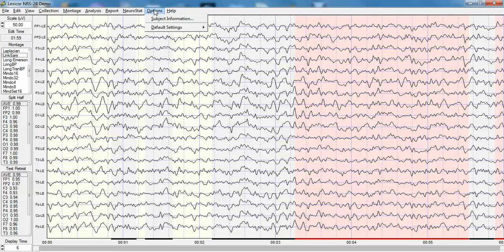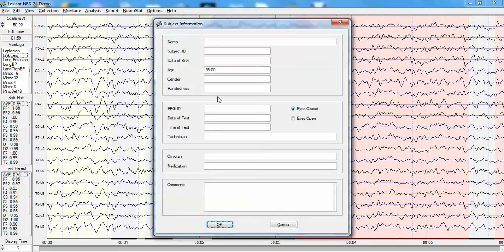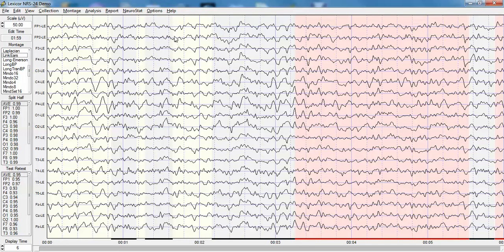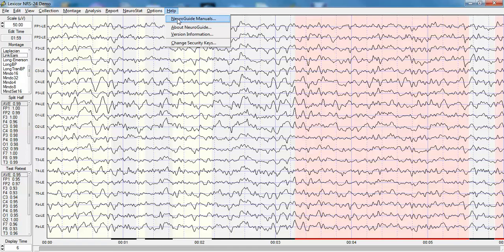And finally, under options, one can set up the subject patient information, in this case it's a patient 55 years of age, in which comments regarding the patient's clinical history can be made, medications at the time of test, etc. This information will be used in the automatic report generator, which is in process of being created for NeuroGuide.